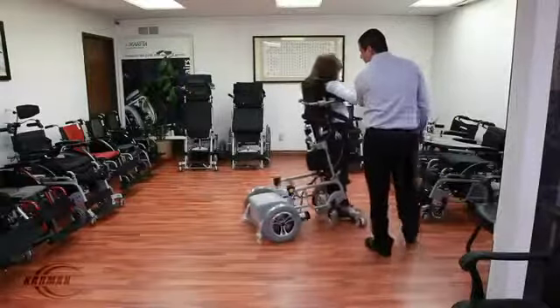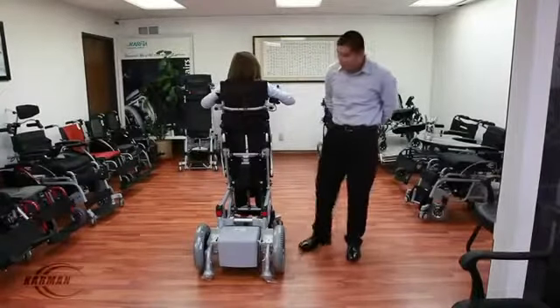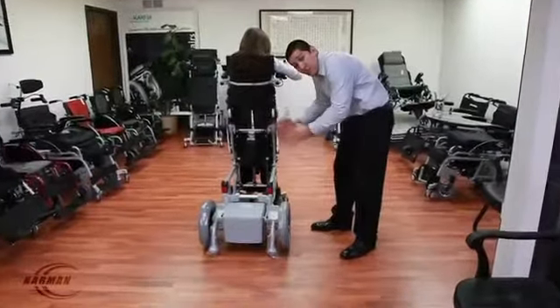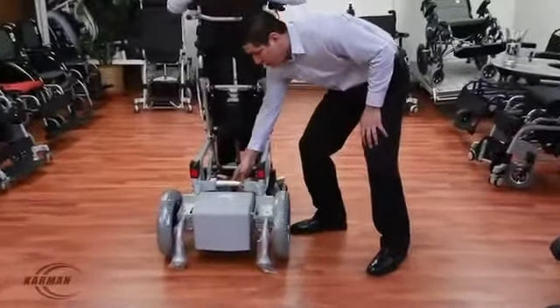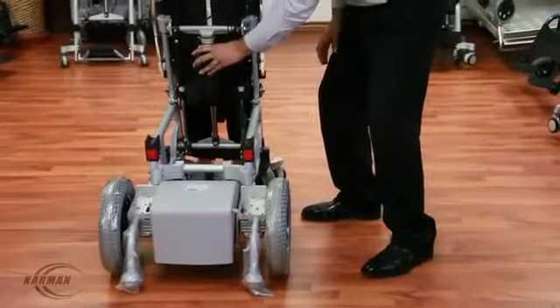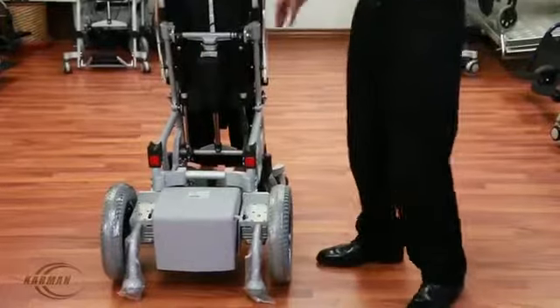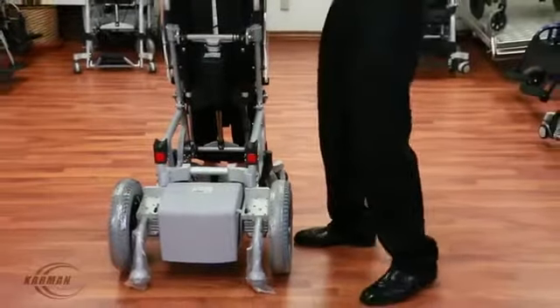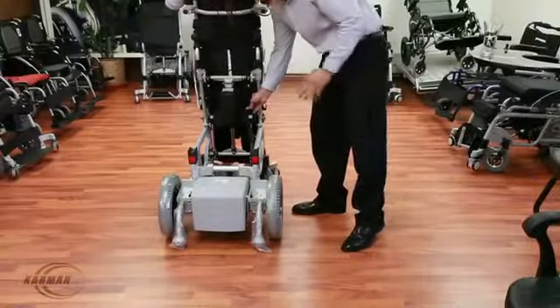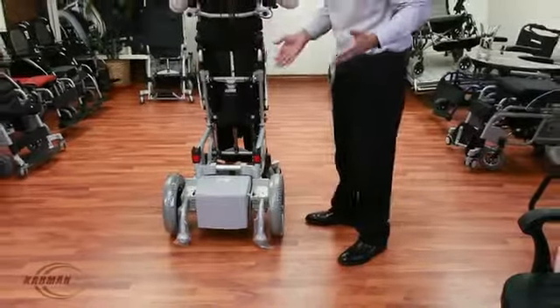Let's show you guys the motor here. This chair has been well designed to be safe with a sturdy construction. At the rear of the chair, it has a rear strut bar to ensure stability over any rough terrain, indoors or outdoors. This has a Lloyd actuator — the Lloyd motor is heavy duty and has been designed to withstand any pressure or weight, with a maximum weight capacity of 250 pounds. There is also a strut bar on top, and two compressed gas cylinders. These struts work like a suspension in a car, ensuring a smoother, softer ride.